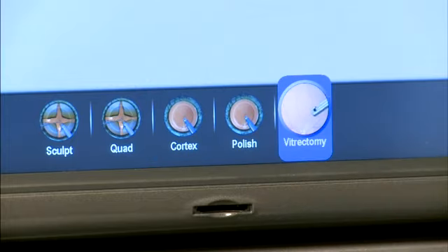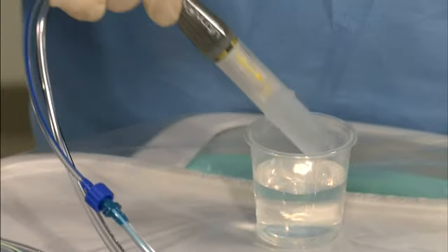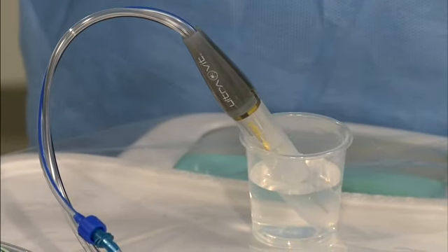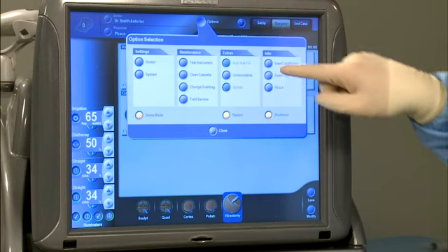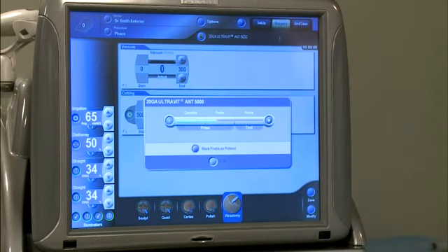Press the anterior vitrectomy icon. To confirm vacuum and probe cutting response, the scrub should place the probe into a BSS solution-filled med cup for test confirmation. Select options on the instrument screen and press the test instrument button, then push the play button. This will test the cut and aspiration functions of the probe.